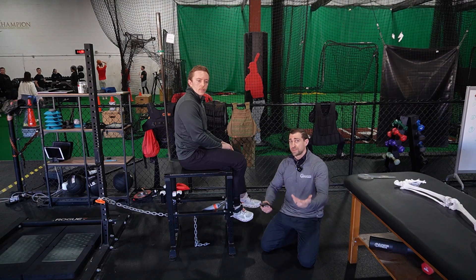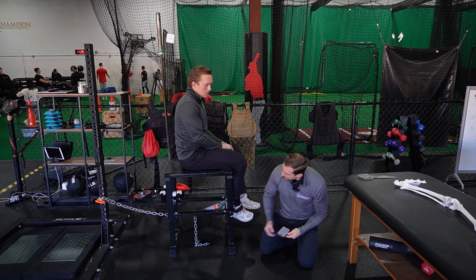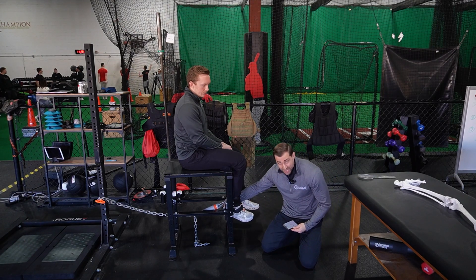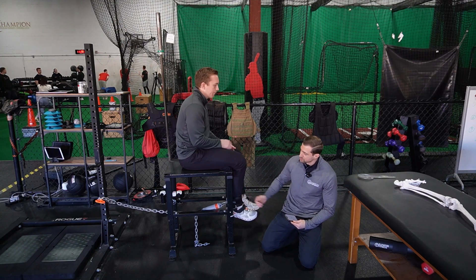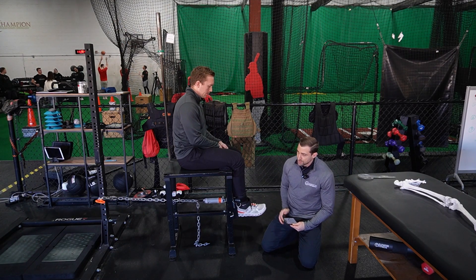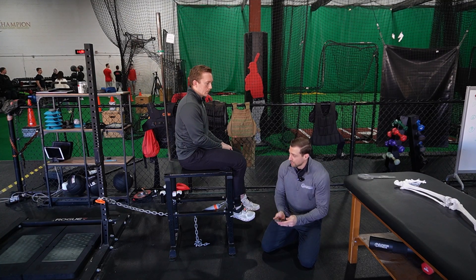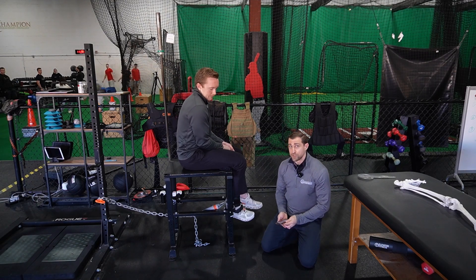There are a lot of different ones on the market, but this is one that we like to use. We have it attached via a chain to something stable — a squat rack — and attached to a strap at the ankle. The idea is that Jacob can push as hard as he possibly wants with no movement, and the Dynamo picks up how much force he produces.